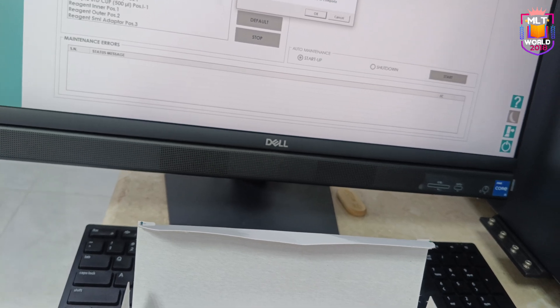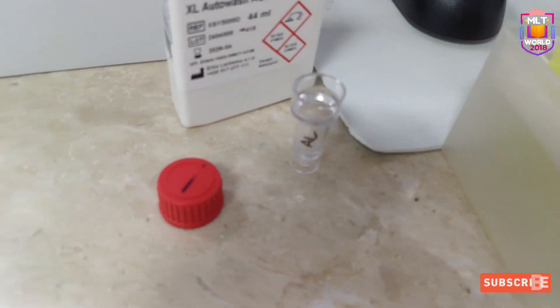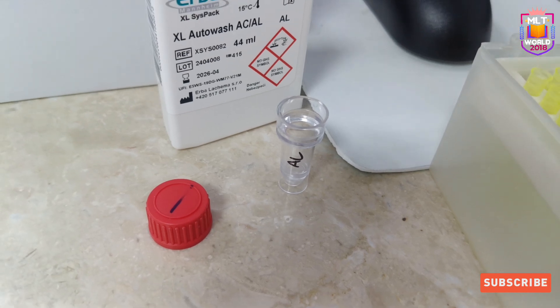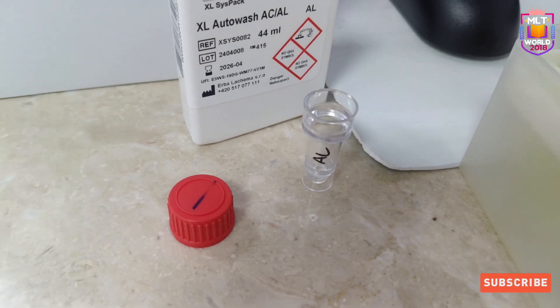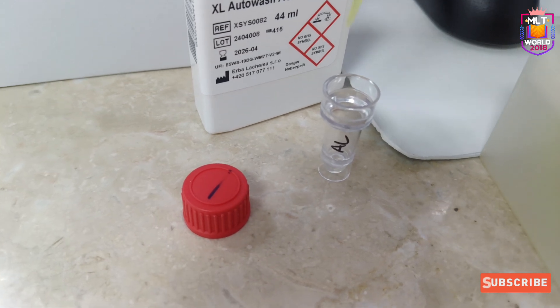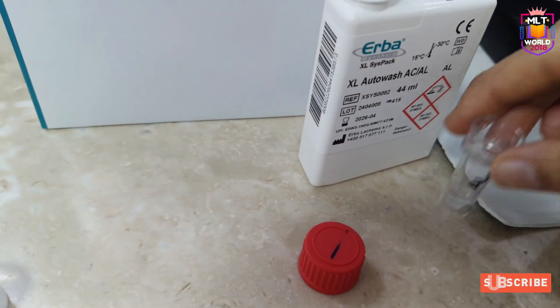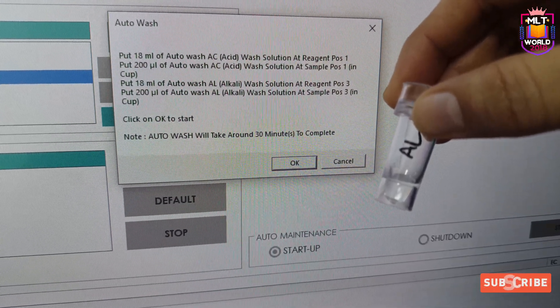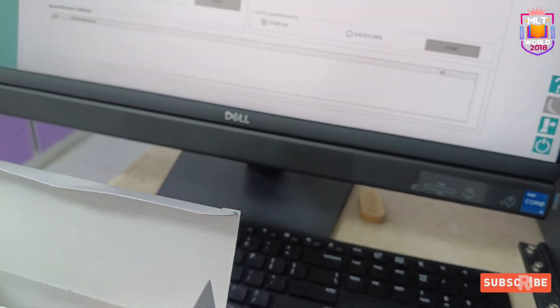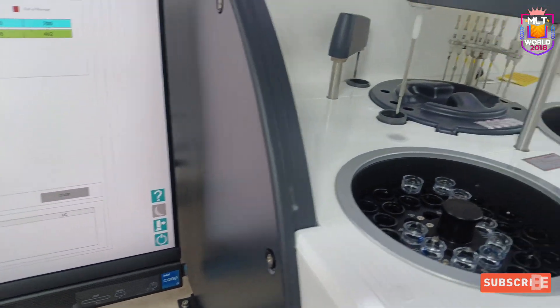Now we prepare the AL solution. AL — 200 microlitres — needs to be kept in position 3 of the sample area, and 18 ml goes in position 3 of the reagent tray. Just be careful: there should be no bubbles in the cup or in the reagent tray. Bubbles will affect the maintenance by introducing air during pipetting.